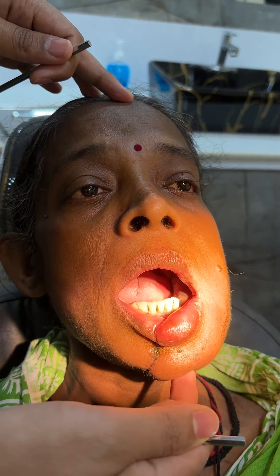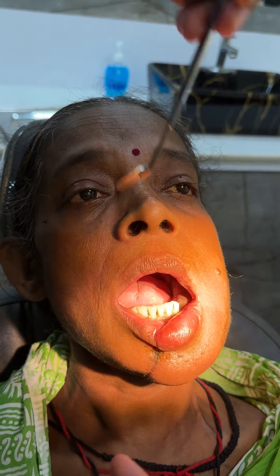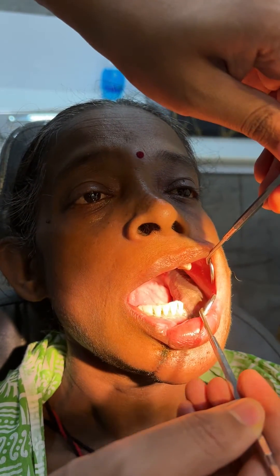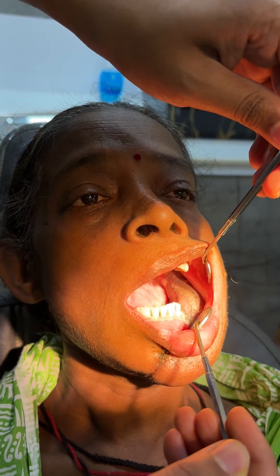That is how we can use a free fibular flap to reconstruct the mandibular defect and maintain good symmetry of the mandible.